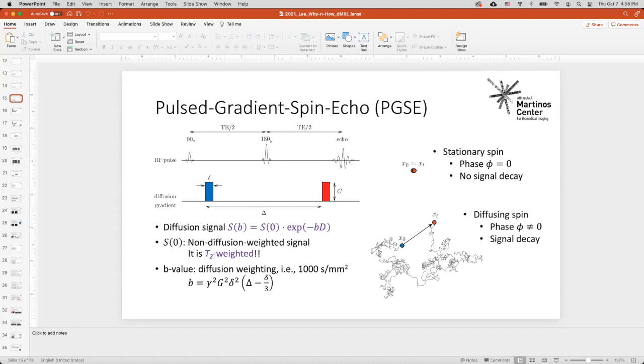But for each slab image, they have different slice excitation, so different slice profile. And we can use this independent slice profile to increase the kind of super resolution, increase the resolution across the slice, but still maintain the SNR, because we get a slab image. So there are more spins in a thicker slab.